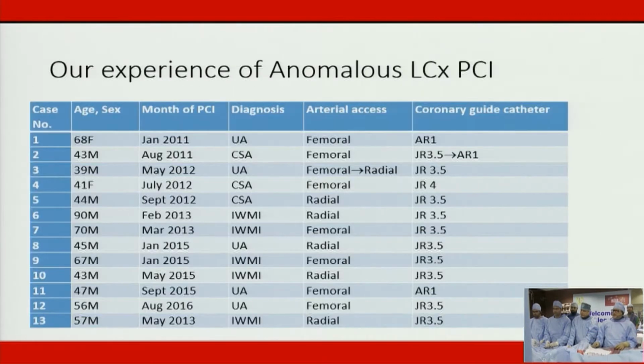And this is our experience of anomalous LCX arising from the RCA and the PCI. A total of 13 cases have been done in the department by me and my team. Most of the time I have used AR1 and JR 3.5 or 4.